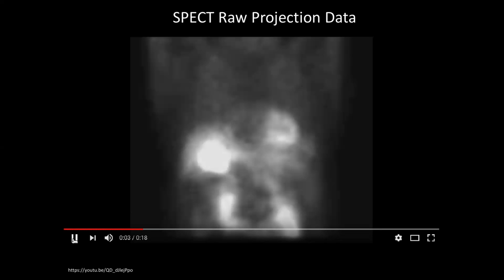Specifically, if all you're looking for is one hotspot, if you want to decide whether or not, say, a primary tumor has thrown a met to the liver, right? So you have a metastasis of something that's gone from your brain tumor down to your liver. You do one of these and you just look for a bright spot in the liver, right? And it's a binary decision. So you don't really need high resolution. You just need a yes or a no.